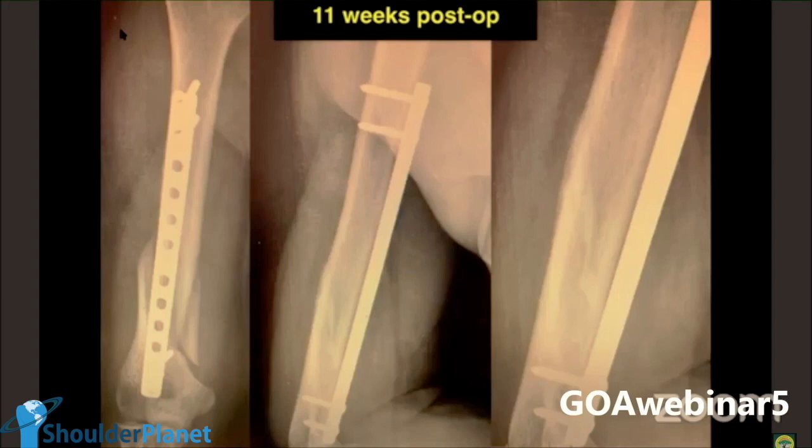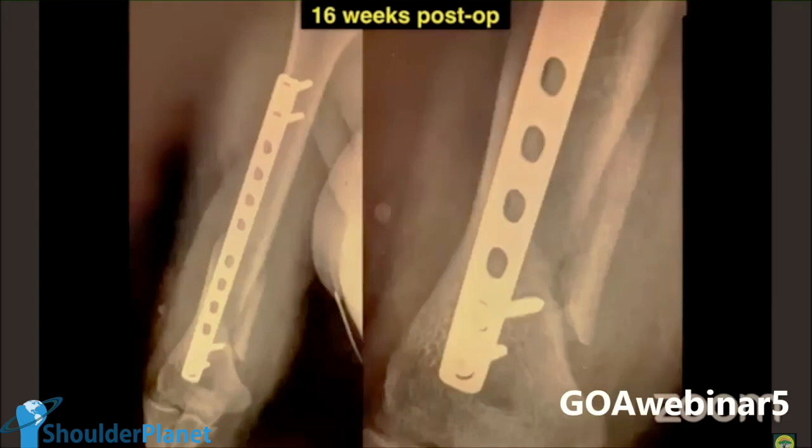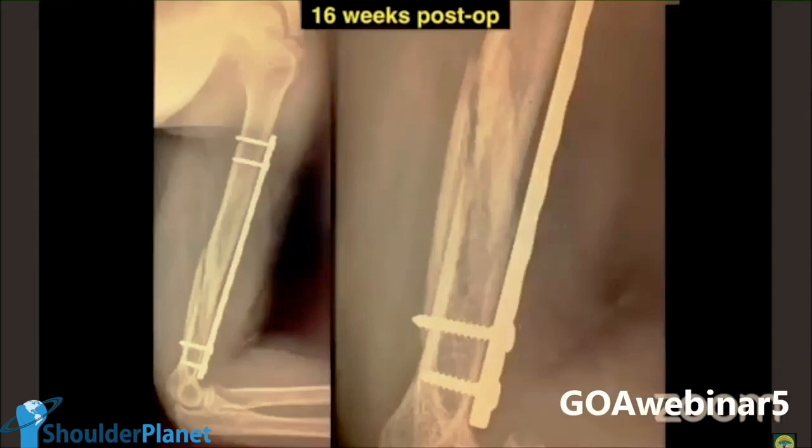Sergio, do we have a problem? No, you just have to wait, because when you see the patient with 16 weeks, see the image on the right side, it's lovely. And this bone is going to remodel for 1 year, 2 years, it's written in Rockwood, Campbell, Jupiter, and many other books, because remodeling is a process that goes on. If you see this with 16 weeks, there is callus formation posteriorly, and I like to see these patients for a lot of time to document the radiographical healing, but clinically, it's done.